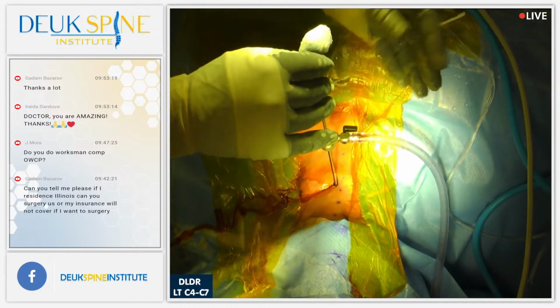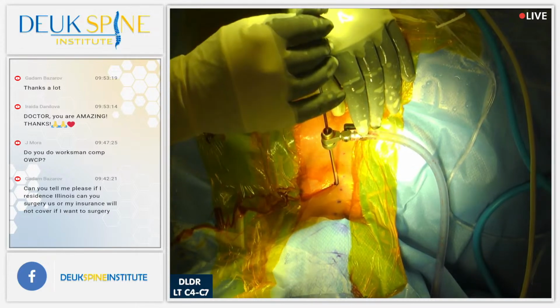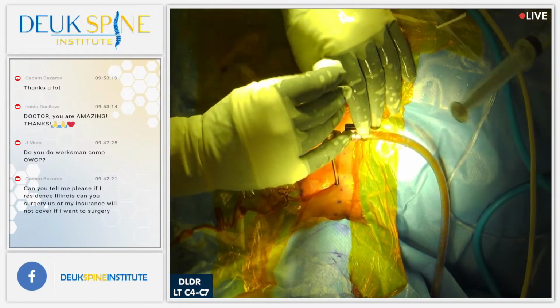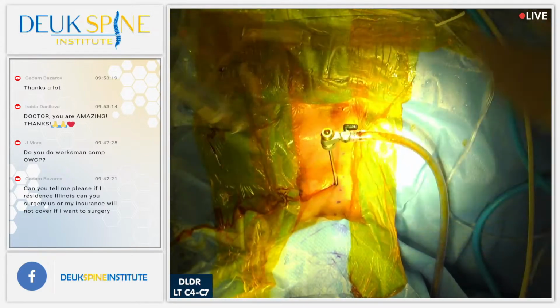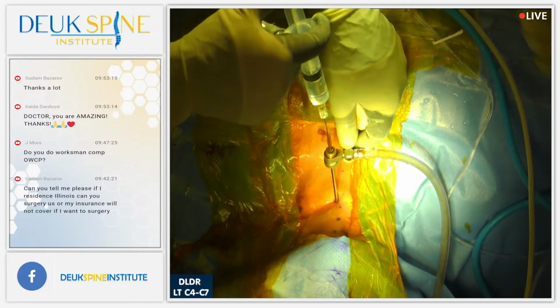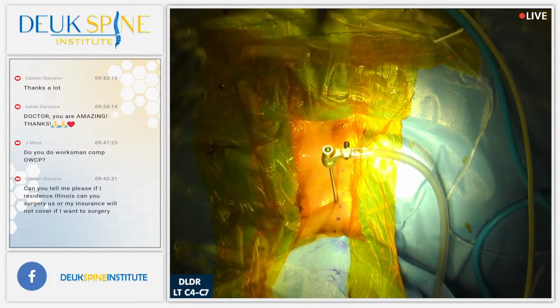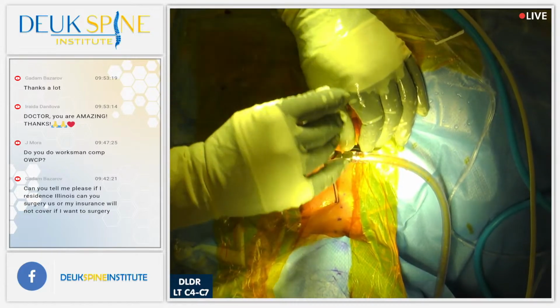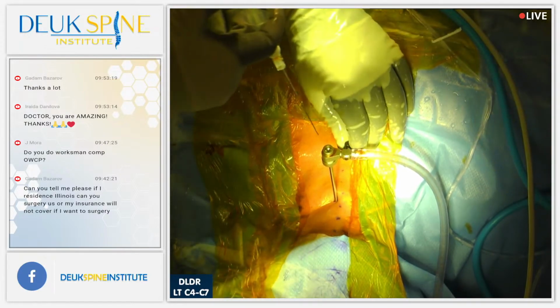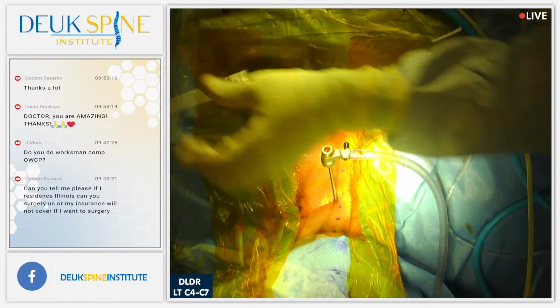I have no suction, guys. Hello, ladies, no suction. No suction on the, there we go, thank you. What happened? Did it come loose? Oh. I thought I would have to start sucking on it like a straw. Huh? Right? I'm just kidding. You know, surgeons can have a sense of humor and still do good work. All right, did you start the video? Not yet. No, I will right now.